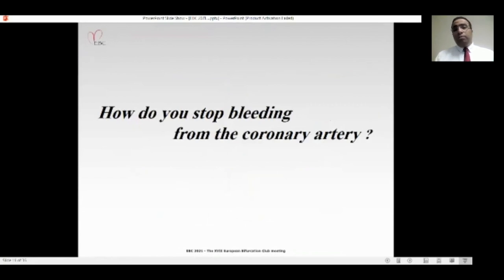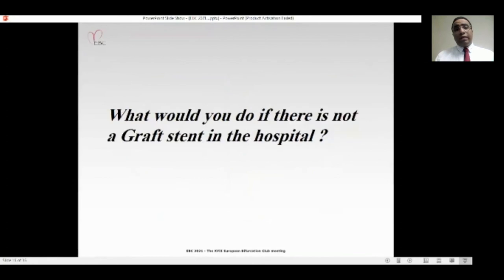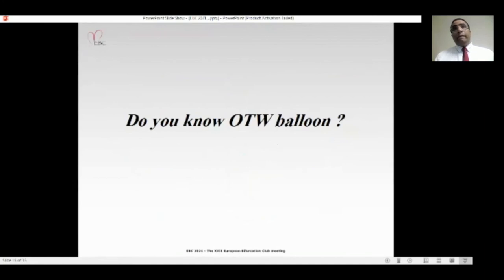How do you stop bleeding from the coronary artery? So I decided to go to the next step, to search for the covered stent graft. But this was the second surprise: I didn't find a sizable covered stent at this moment. So, the over-the-wire balloon. I was lucky and the patient was lucky.